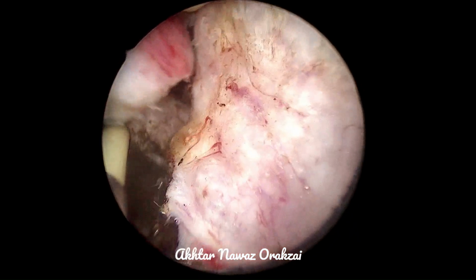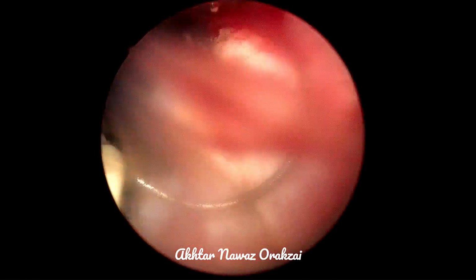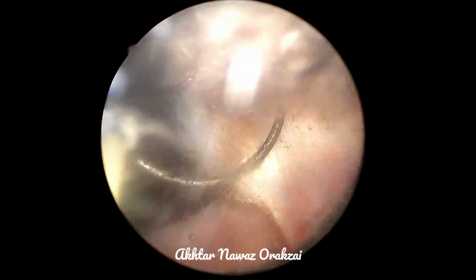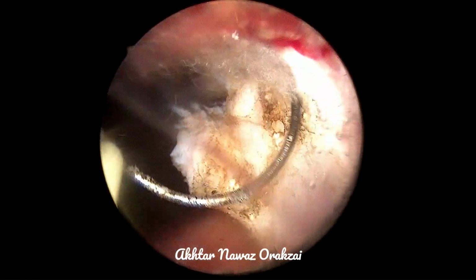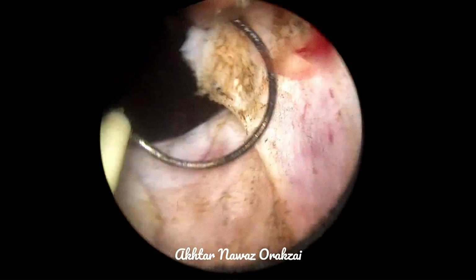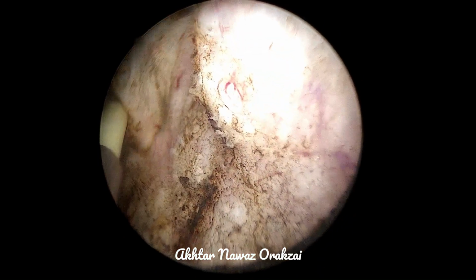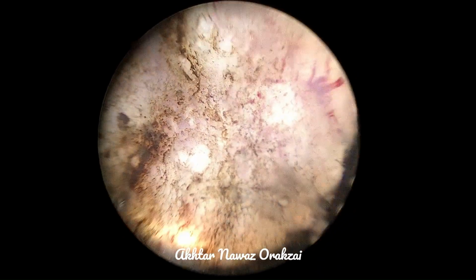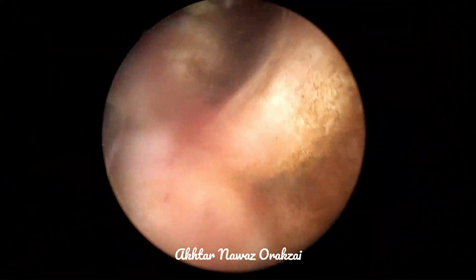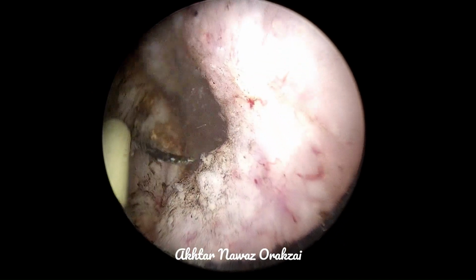As it is an educational video, for better understanding, we will coagulate each and every vessel. Here you can see that there is a spurter. This spurter needs to be coagulated there and then, but we don't usually do the coagulation in such a manner in routine procedures. But for beginners, it is advised that such brisk bleeders are coagulated there and then.